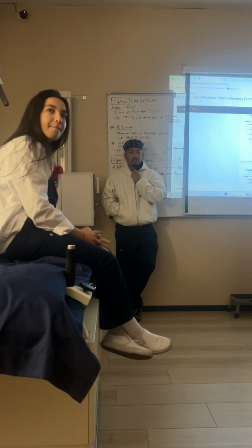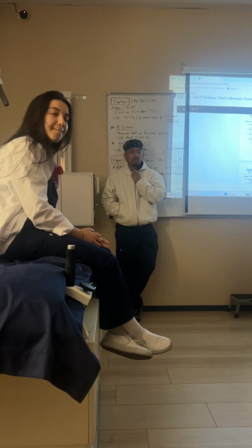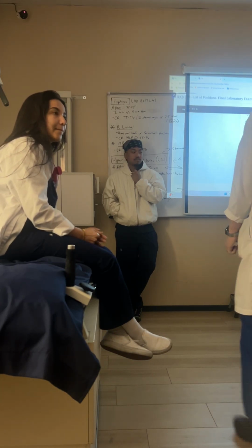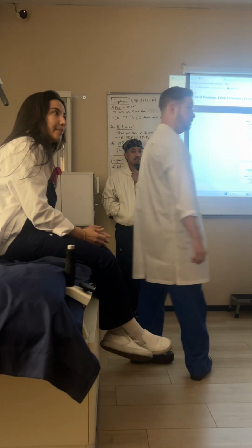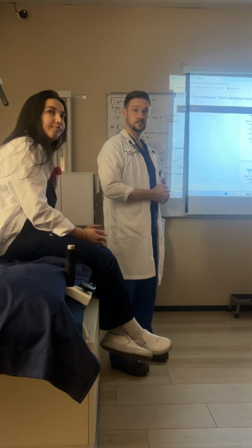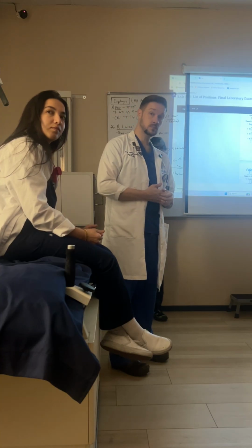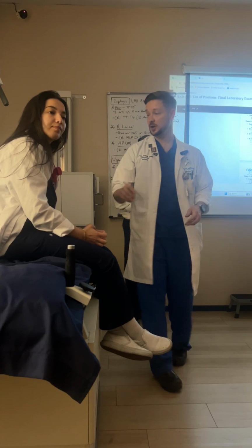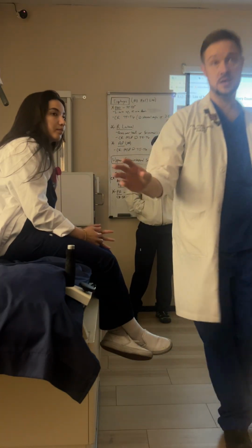Your bottom, squeeze together and hold it in place. So we're explaining the procedure, we're taking the x-rays, whatever we get on the card. So when they're flipping around and all that, you've got to keep this baby in. So that means that you'll probably go from here to here.